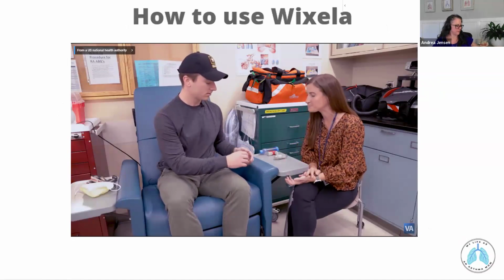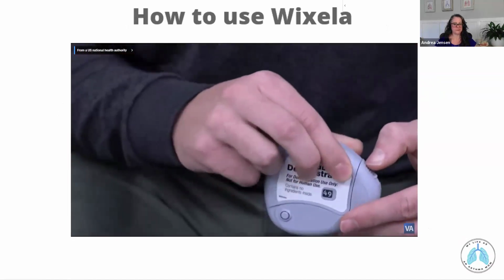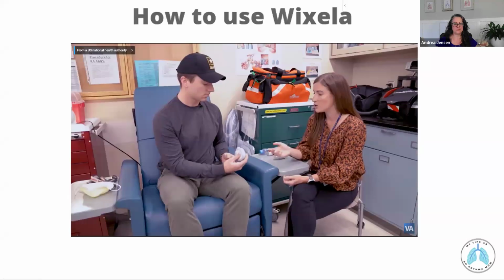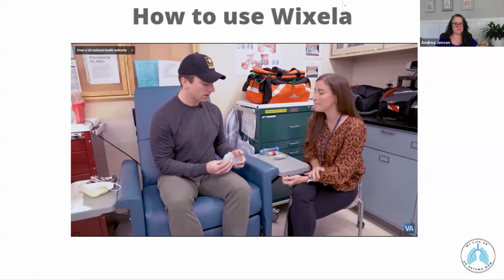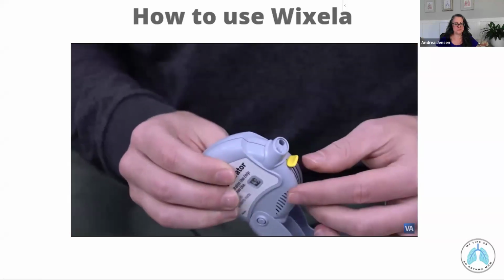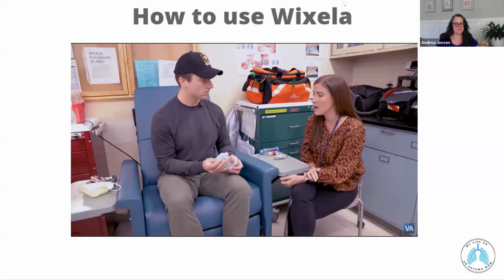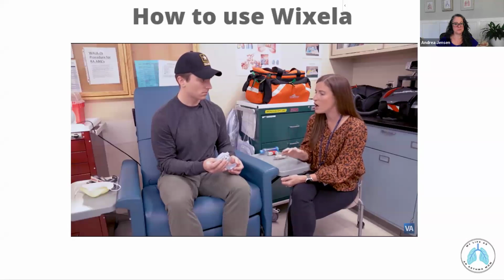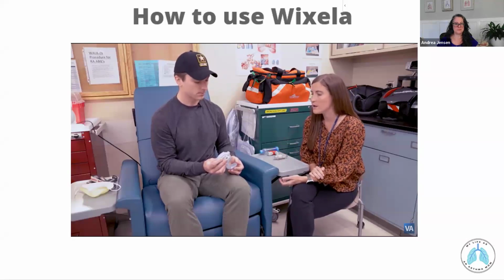Okay. First, you're going to open the inhaler. There's a little grip on the side there, so just pull that down. Perfect. Your holder there at the bottom, just always keep that towards the bottom. Okay. Next, there's a yellow tab inside the inhaler. Pull that all the way down. You may or may not hear a click. Once it's all the way down, avoid closing it or maneuvering that lever. Okay. You may waste a dose if you do that.